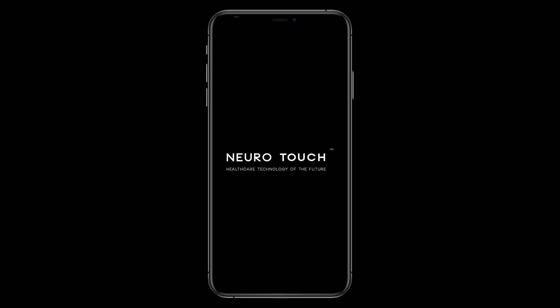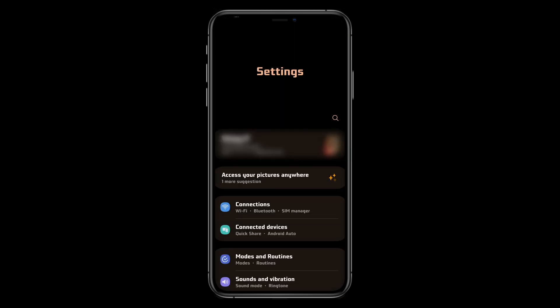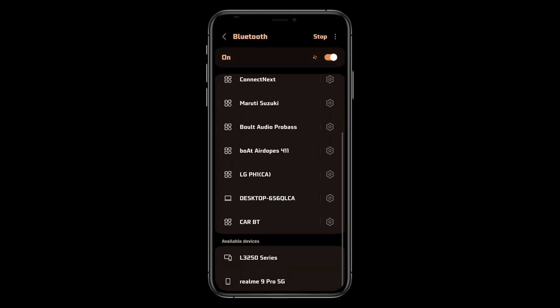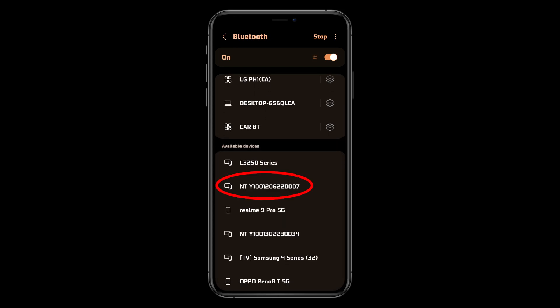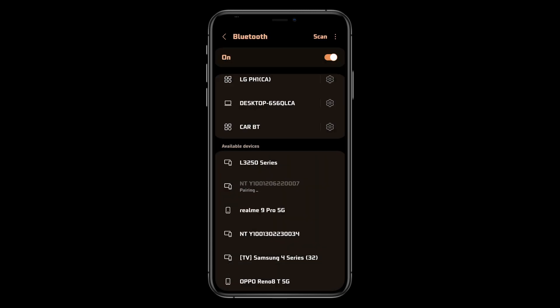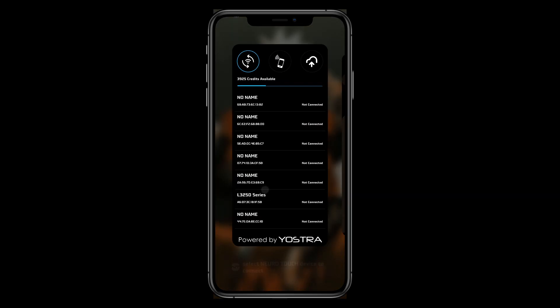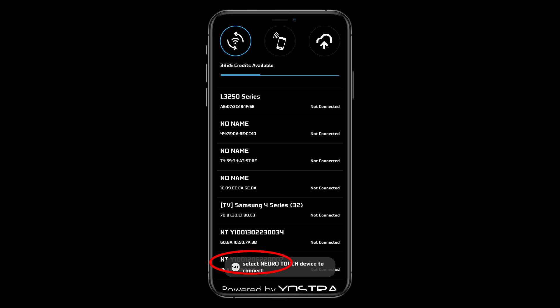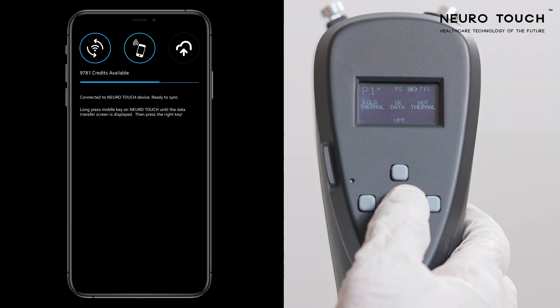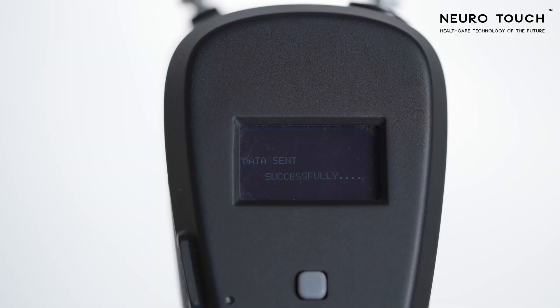If you did not find the device serial number on the app screen, go to the Bluetooth settings. Among the available devices, you will find the NeuroTouch device with the device serial number. Click on it to pair the device. Come back to the NeuroTouch app — the device serial number will appear on the screen. Click on that number to allow pairing. After pairing the device, long press the center key and right arrow key to send the data.